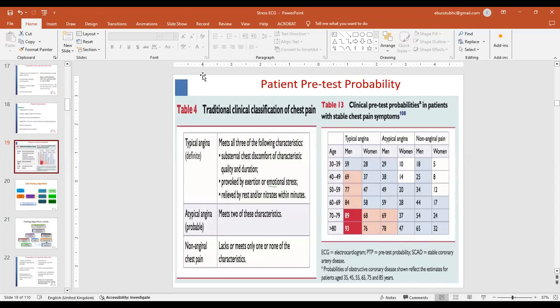Yes, Chief Okofi. I thank you so much, Dr. Sawa. I don't think I have anything to say other than thank you to him for this presentation. Most of the things have been said. I would only mention that the test might not be as easy as we think, especially getting a good report free of artifacts. We need to do our skin preparation very well, because if not, artifacts might not allow us to get a good report.